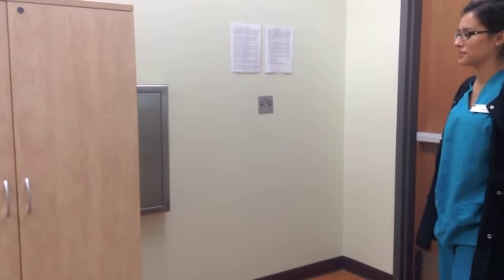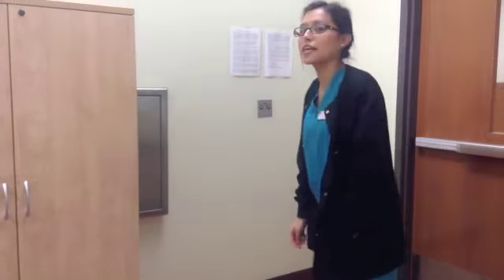Good morning. Today we are making a video on opening and closing the dental office. Okay, so the first thing that you would do to open the office would be turn on the master switches, which is the air compressor and the vacuum system. Now we're going to go to the reception area.